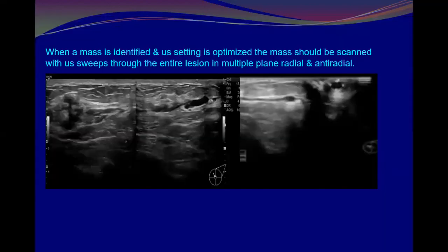And what is going on here? This is again a heterogeneous, suspicious lesion, but when I also see the irregular ducts going down to the nipple, and even here the papilla within the nipple is stretched and dilated. That means if it is seen only here, it will be BI-RADS 4C, but along with this ductal extension, definitely it will be upgraded to BI-RADS 5.